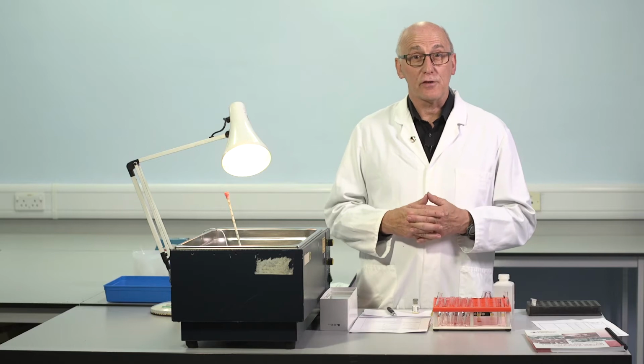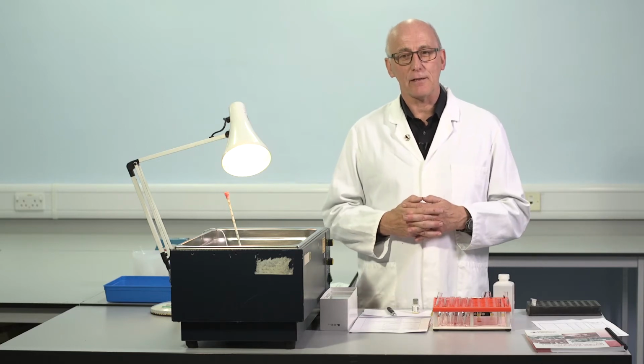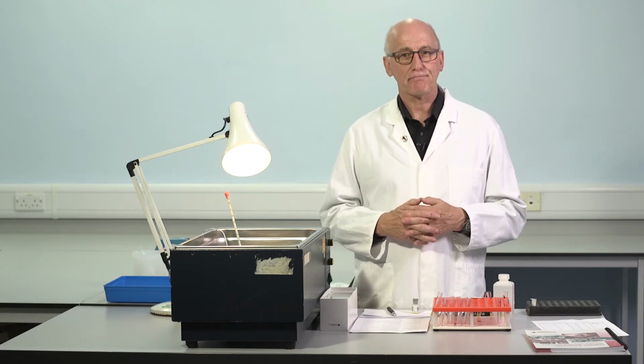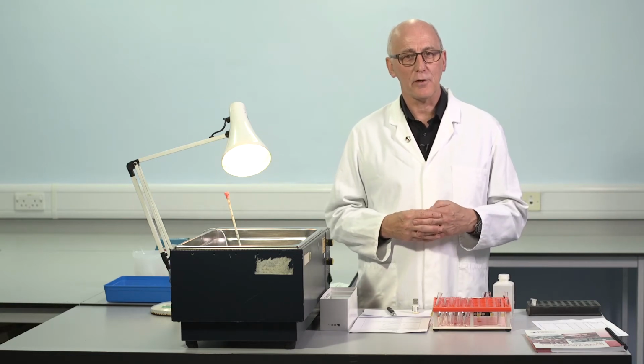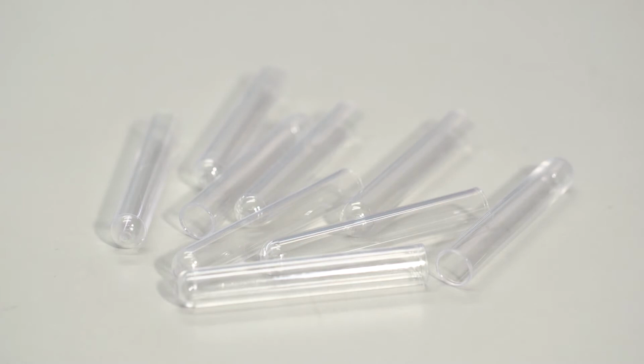The tubes which we use, the receptacles we use to make these dilutions, is important. We should use plastic tubes which we know will not interfere in clotting in relation to contact activation and so on. So we've got some plastic tubes to do this here. These are ones which we've used before in this assay.